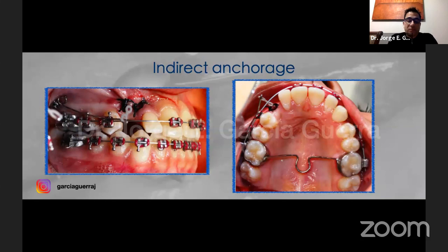One of the problems that I had as a clinician a long time ago was that when we did a radiographic diagnosis, we didn't see exactly the position of our impacted canines. Nowadays we can use the CBCT and see exactly where the canine is, and this is a great way to pull it away from the roots of the lateral incisor, so we can bring out that tooth.